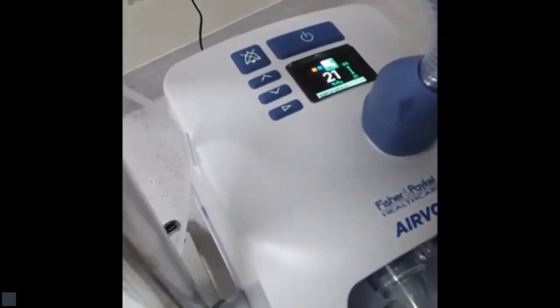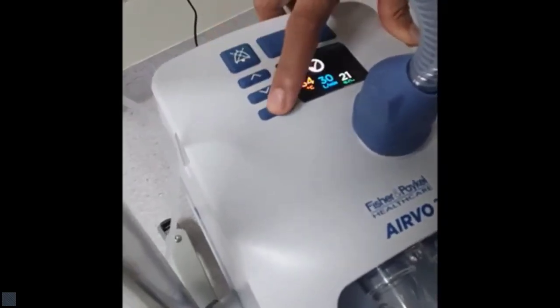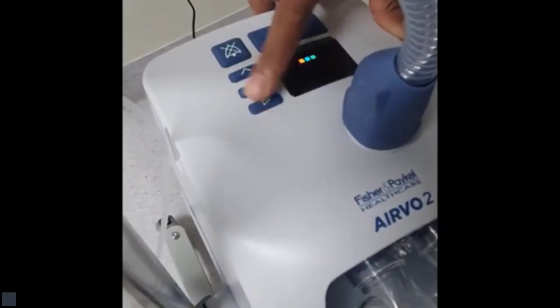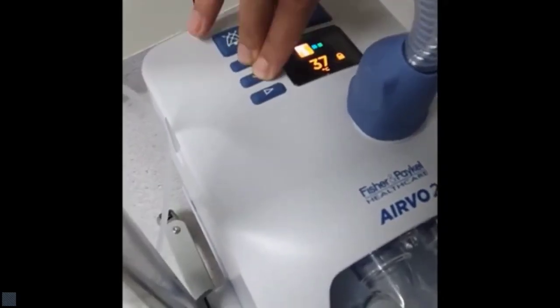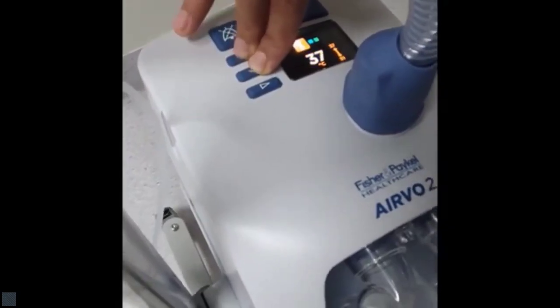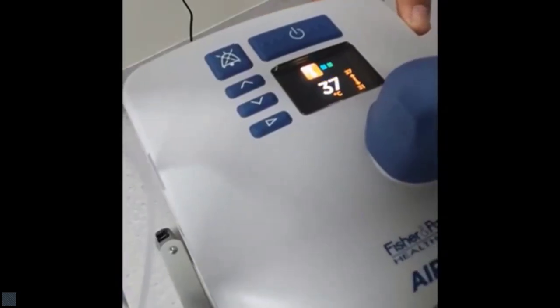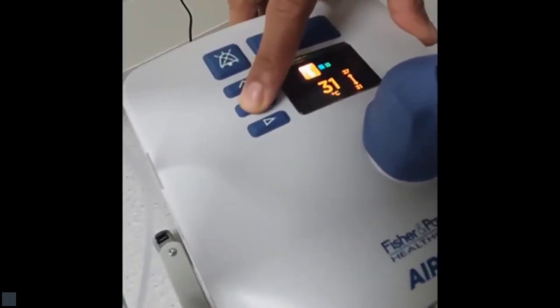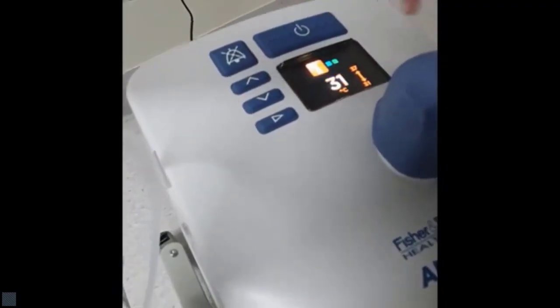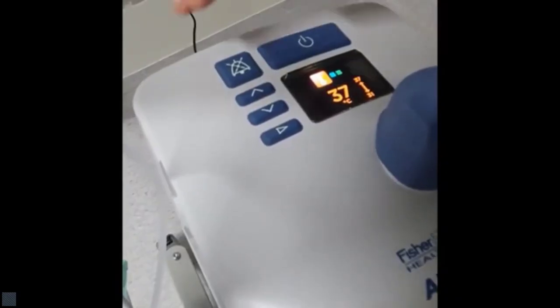Changing temperature: press both up and down buttons together for 3 seconds, as shown, to unlock settings. The padlock symbol will now disappear. Use the up or down arrows to adjust temperature. The recommended temperature is 37 degrees Celsius. Press and release the mode button to lock the screen.